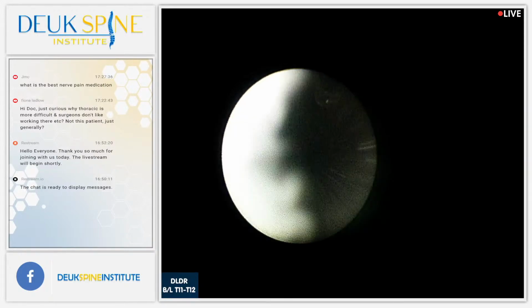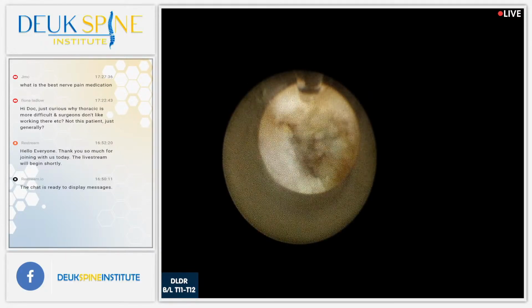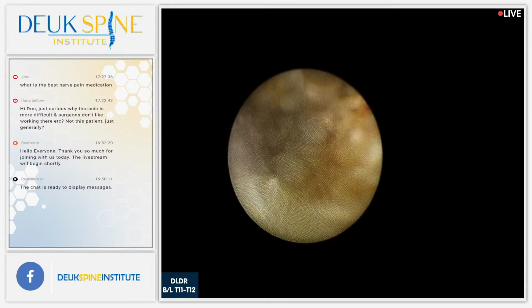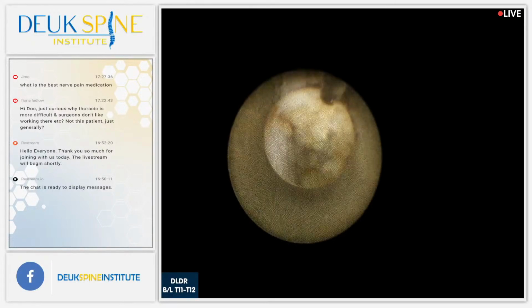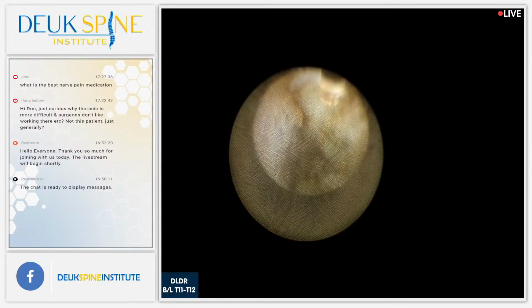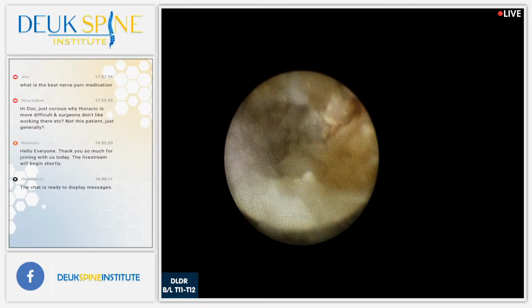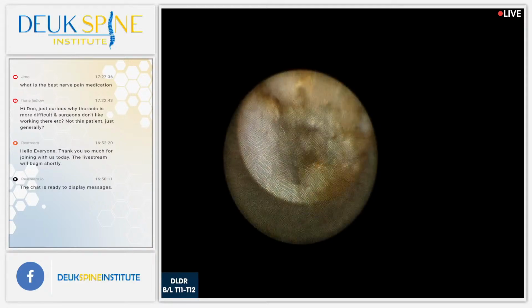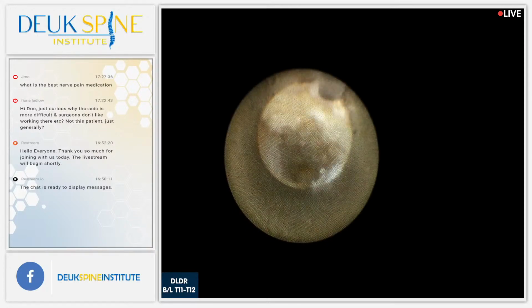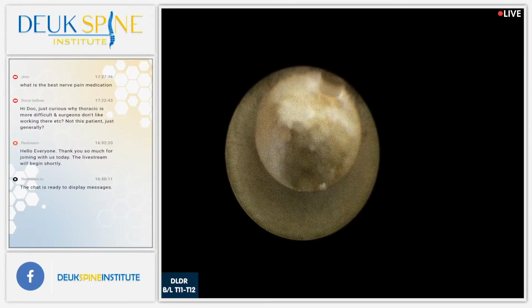And unfortunately, over time, the response, we're almost done, 5 minutes, doctor. Unfortunately, the response of the human body to a herniated disc is to attack it and make scar tissue and calcium. And that's what's happened here. So I think she probably fractured her spine at the same time she herniated the disc. And the fracture healed for the most part, but the herniation never did. And it ended up causing pain. And now so much scar tissue, callus, that it's pinching the spinal cord.